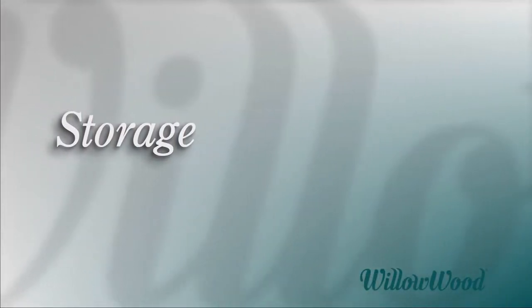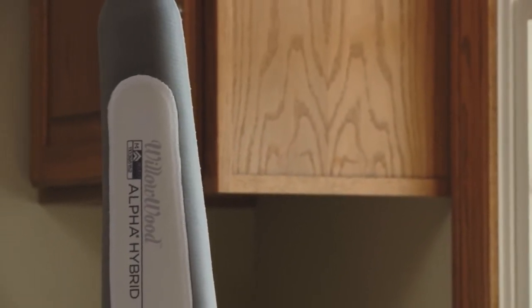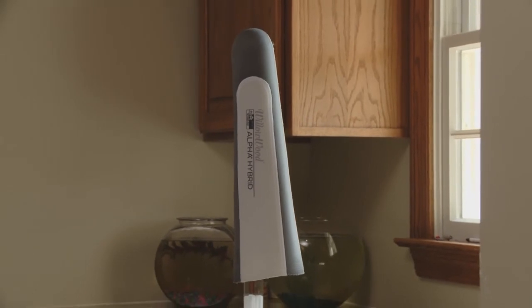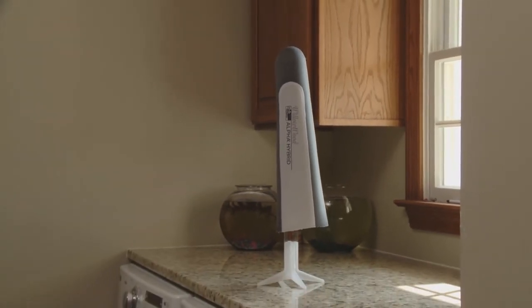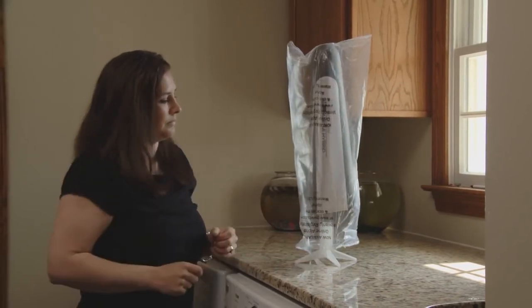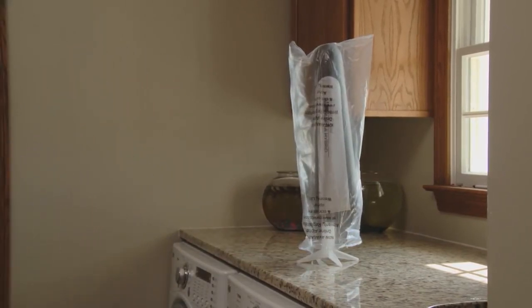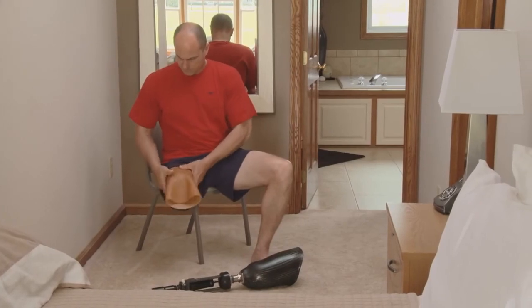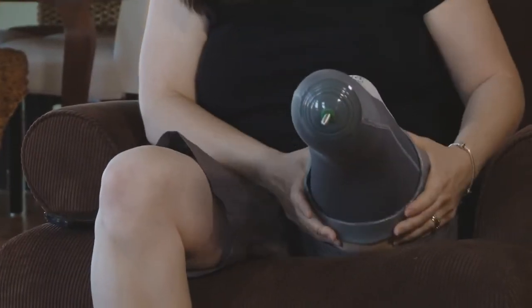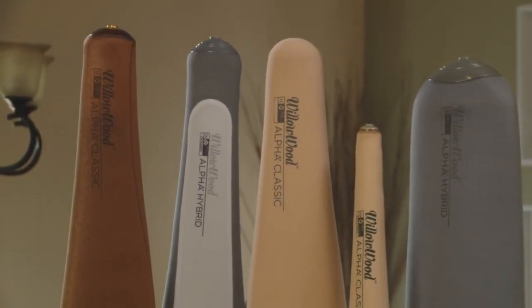When your alpha liners are not being worn, they should be stored in a cool, dry place, out of reach of children and pets. If a liner will not be used for an extended period, cover the dry liner with a clean plastic bag. By following the simple steps in this video, you will be helping to obtain the highest level of comfort and the longest possible life from your alpha liner.